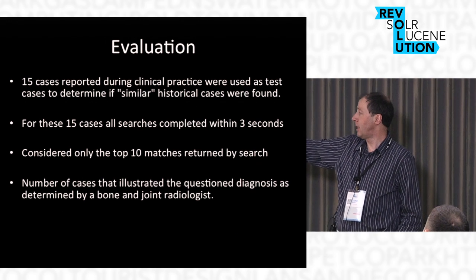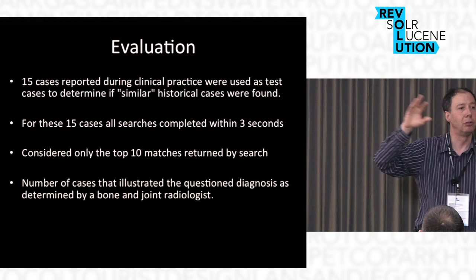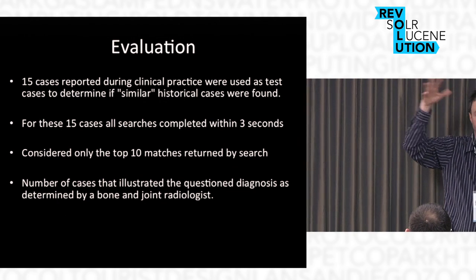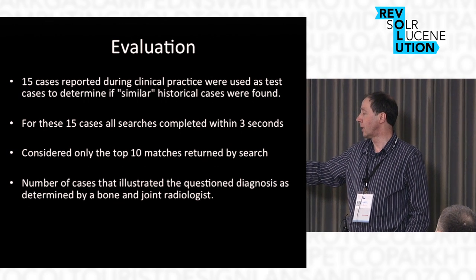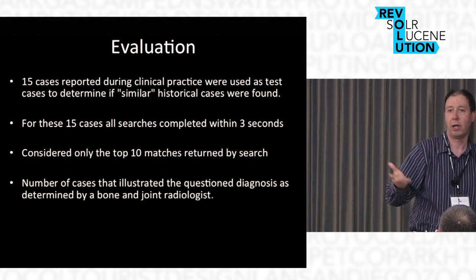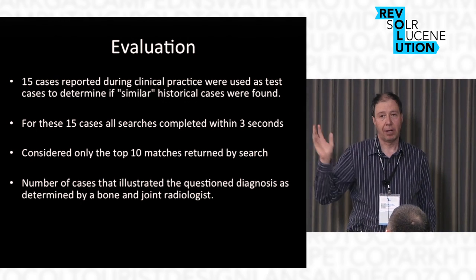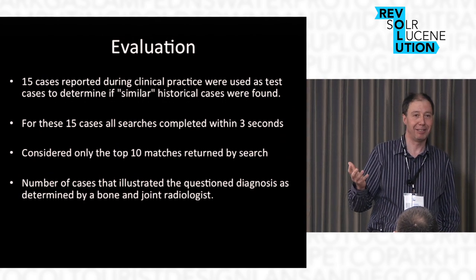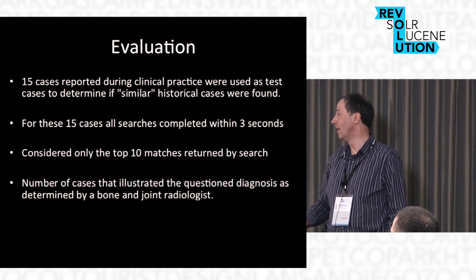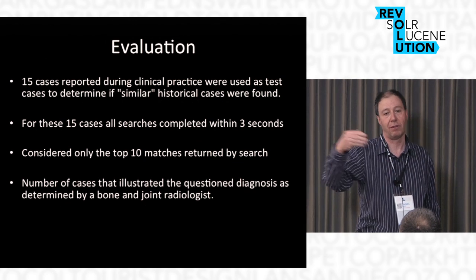But we looked at the top 10 returns from the Solr search. By the way, we were using LucidWorks on top of it. That was what we were actually using. And then we wanted to count, just as a raw evaluation, how well the search was doing. Now, one problem, and I'll get into this a little bit later, is I can't tell which ones are good or not, so I can't debug this unless Dave's sitting next to me. So we had a bone and joint radiologist look at this and say, yes, this is relevant. No, that's not relevant.